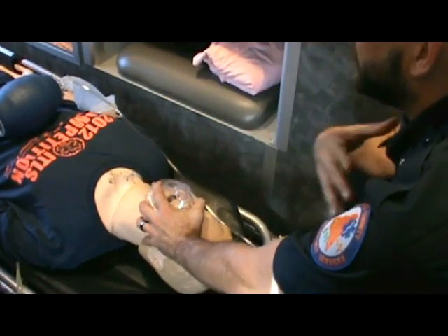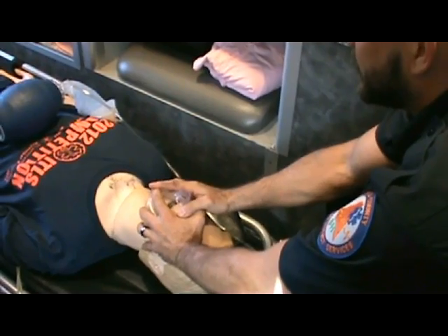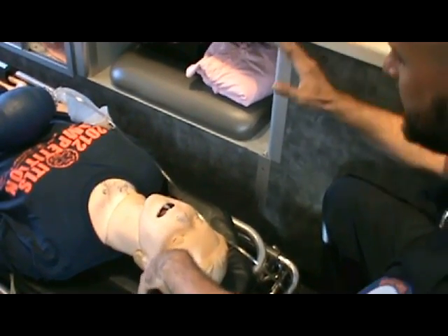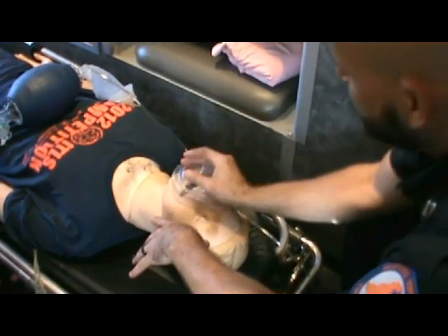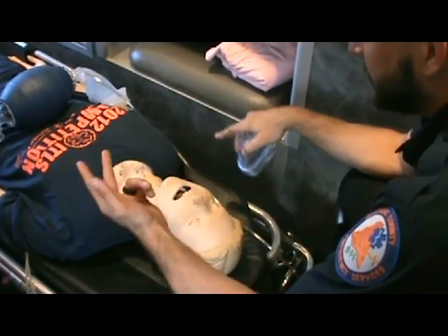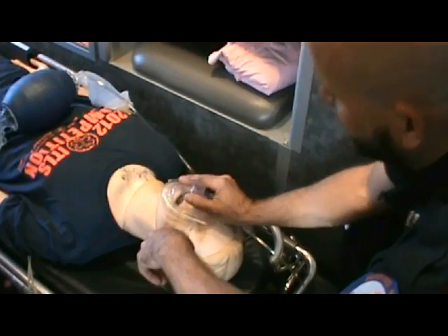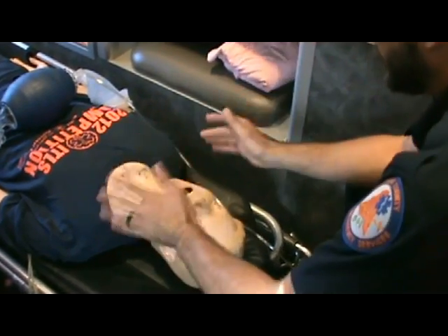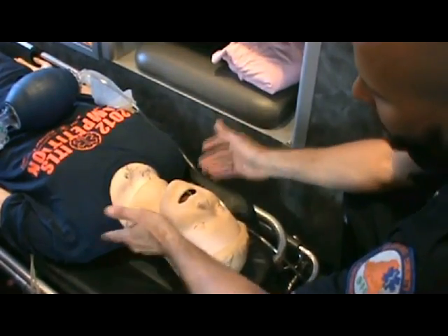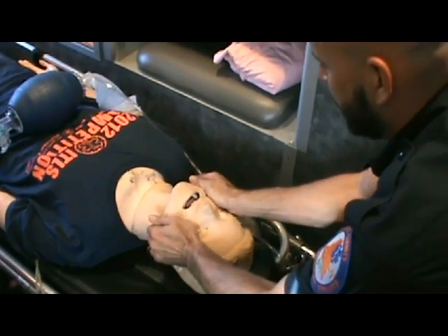Before having the most experienced person do the squeezing, let me show you how to position the patient for the best seal. You might have difficulty if they have a beard, loss of facial or bony structure from trauma, no dentures, or age-related tissue deterioration — all of these can cause problems with the seal.